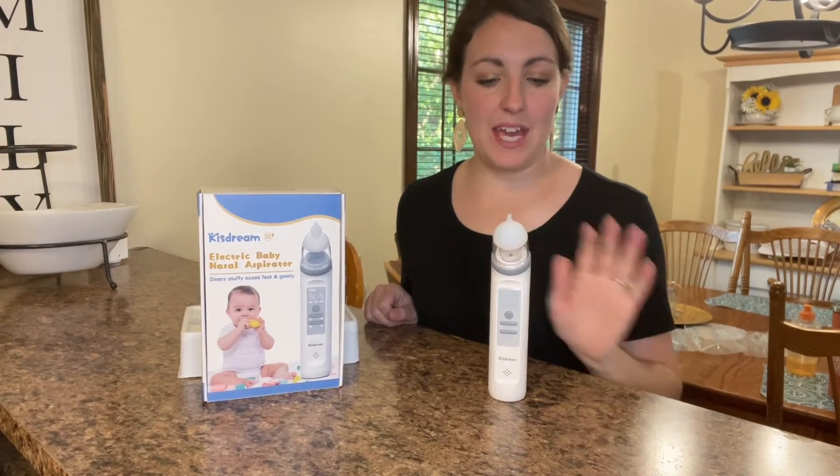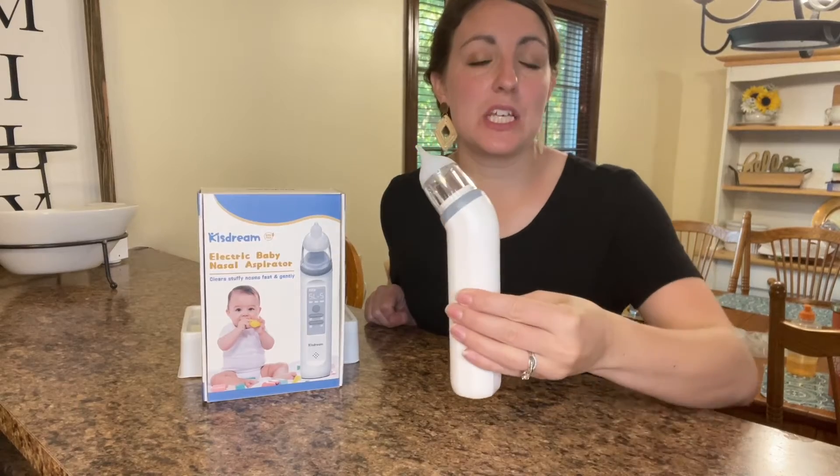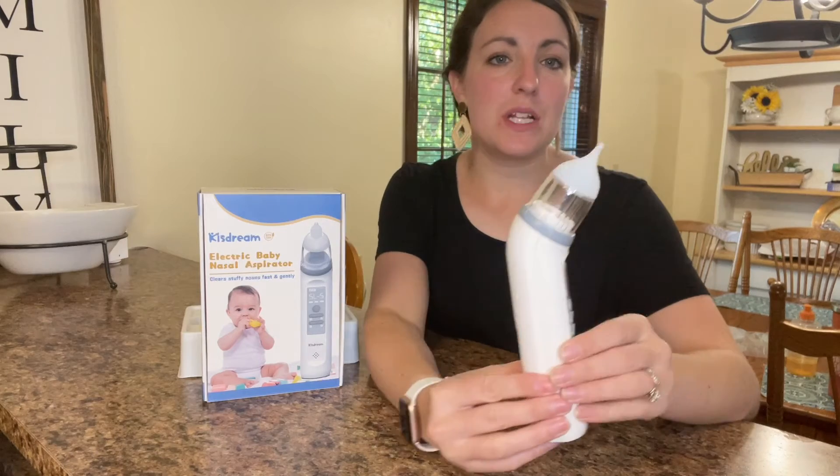Hi guys, welcome. Today I have a nose aspirator for us. This is a tool that you're able to use to help alleviate the congestion in your little one's nose.